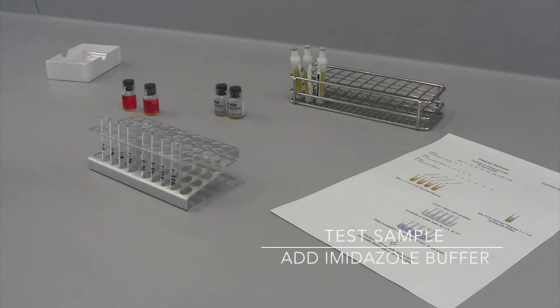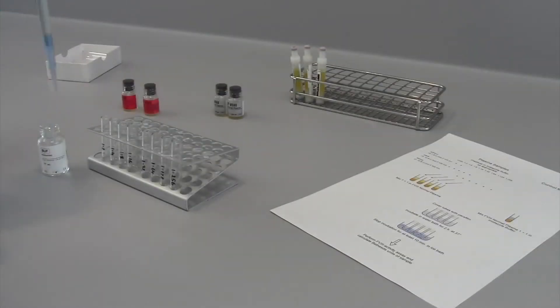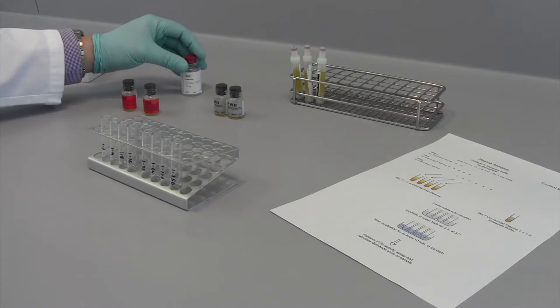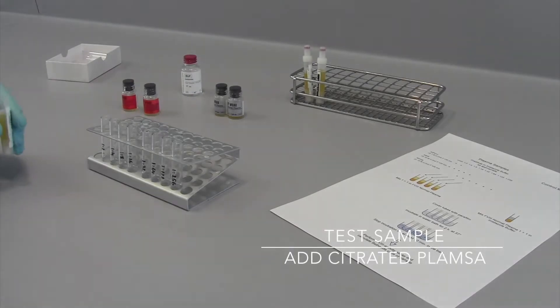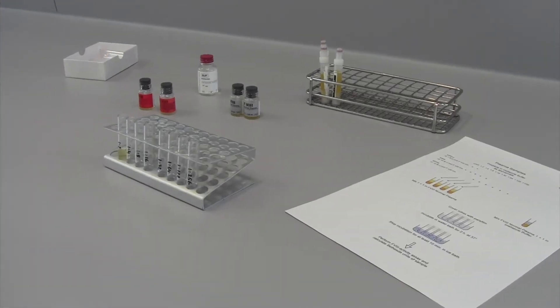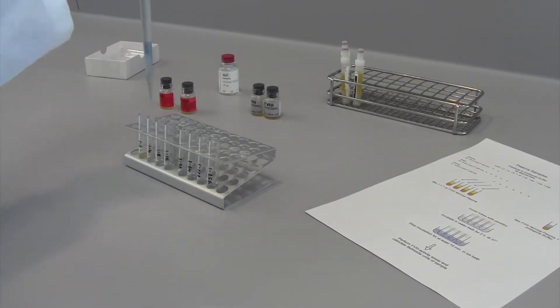Please pre-label the tubes and add 500 microliters of imidazole buffer to each dilution tube. Thereafter, add 500 microliters of sample plasma to the first dilution tube. Now, continue the dilution by transferring equal volumes from tube to tube. Please ensure adequate mixing.